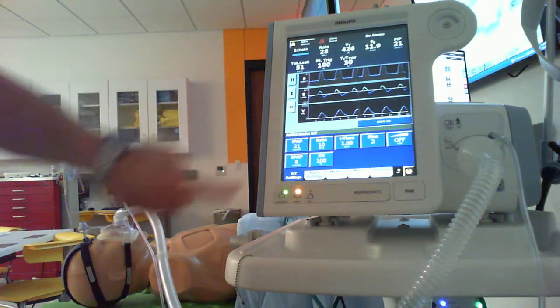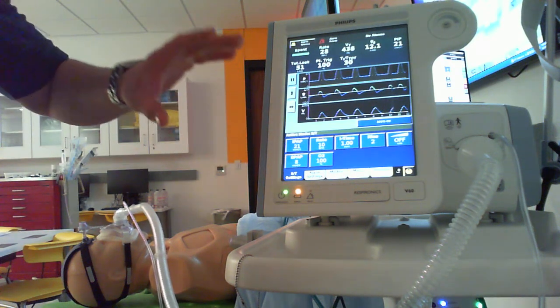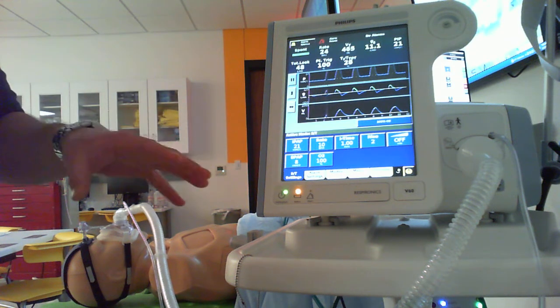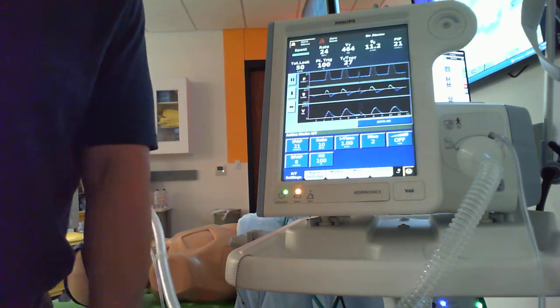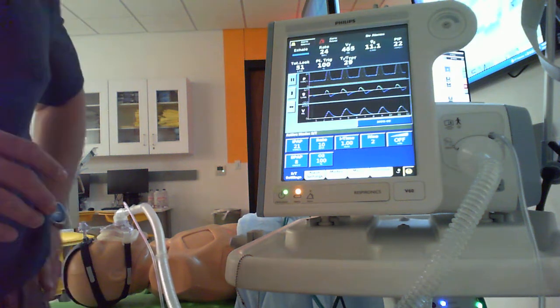Now, one last thing you want to be cautious about is your IPAP. I'm not saying you can't go above 20. This machine goes way higher, but you need to pump the brakes before you start going above 20 centimeters of water. Most patients, you're going to see that their esophagus potentially opens at pressures in that 20 to 25 centimeters of water range, okay?